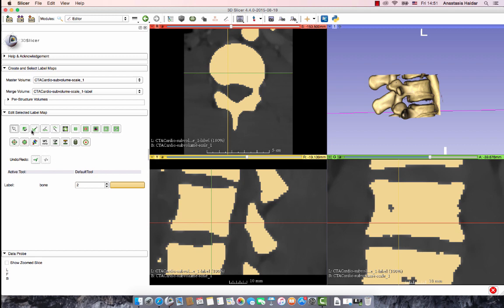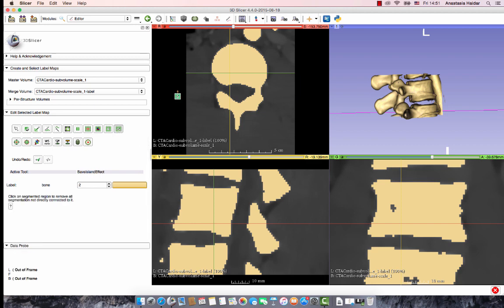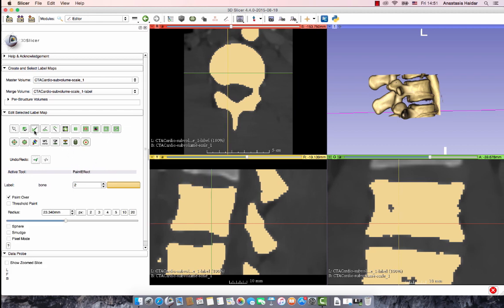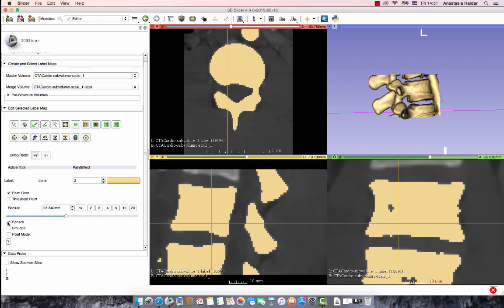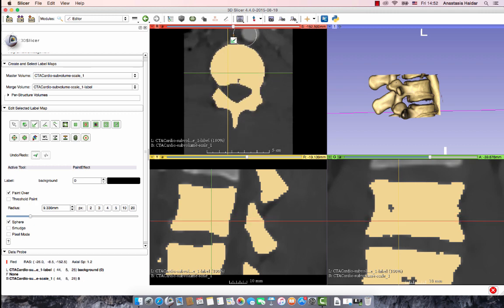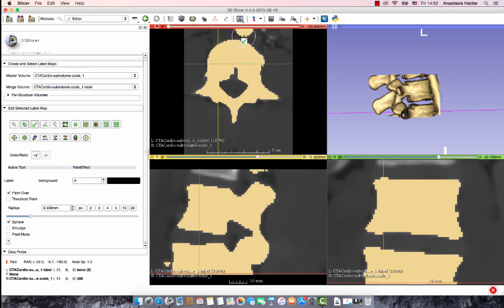Tools like the Level Tracing effect, the Rectangle effect, and the Paint effect work most efficiently. To start the editing, use the Save Island effect to get rid of anything segmented that isn't directly connected to what you click on. Then using the Paint effect, you can select the sphere shape which uses the segmentation you've done and applies it to other slices above and below it. The sphere's radius can be changed to segment more precisely. By clicking on one of the tools and the eraser, any part of what you segmented can be erased manually. I mainly use the Paint effect to get rid of any segmentation that I didn't need, but you are welcome to use any other tools that would work more efficiently.